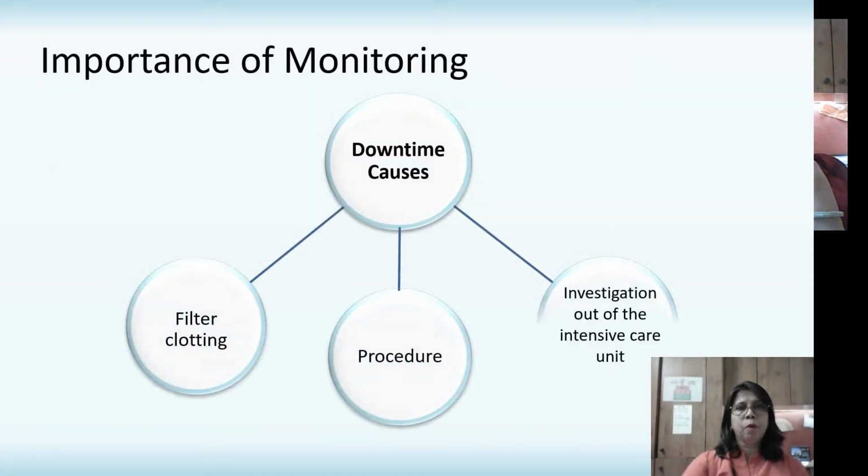Despite the best of the monitoring and the best of the intentions, CRRT therapy is often interrupted, especially with critically ill patients. And this is known as the downtime of CRRT. One of the common reasons for downtime is filter clotting, which may occur due to various reasons.